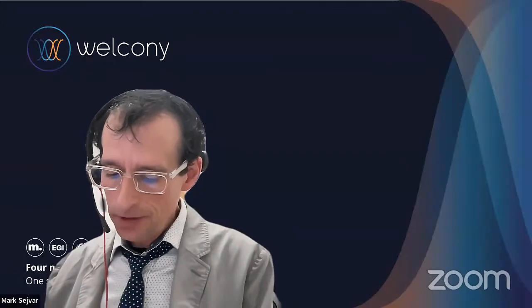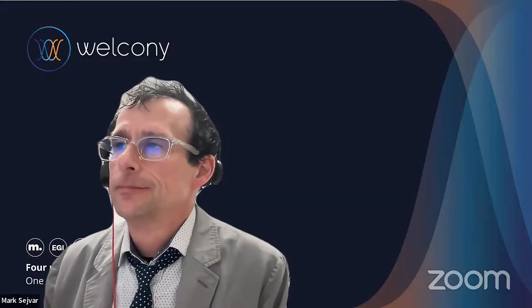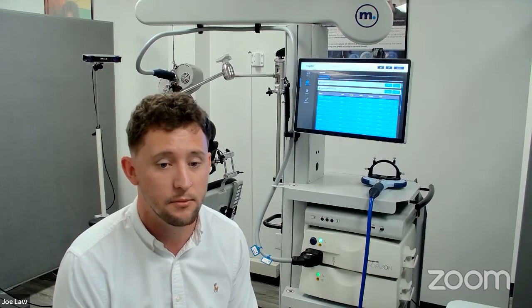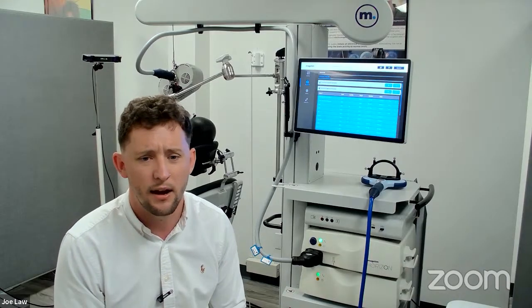Hey, Joe, there's a question about how long does it typically take to service a system? And this is what you do, so I'll let you answer that. Great question. So there's a couple of things we can do. We do a preventative maintenance service. It's not something that's required, but we understand some clinics have processes that need sign off from the manufacturer. So we do have a preventative maintenance service available for our clinics. That means somebody will come out and they will do a visual and functional inspection on the system. That can usually take around an hour and a half, but it is done by a Magstim rep.